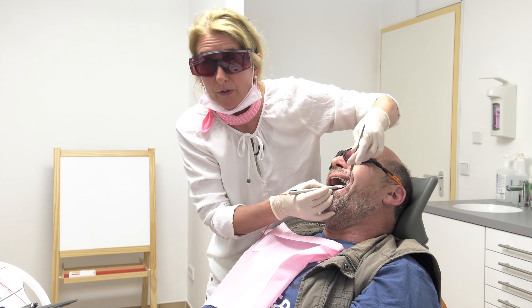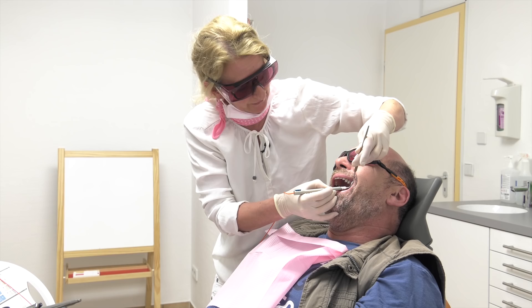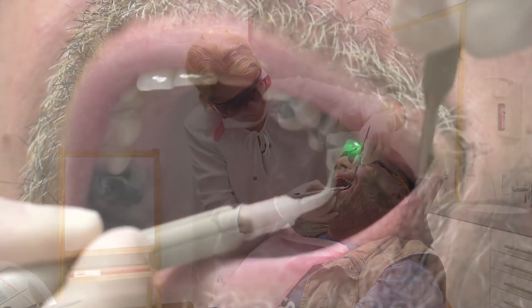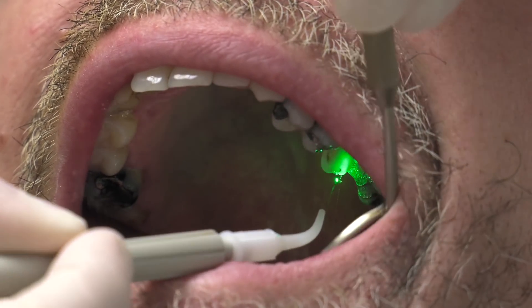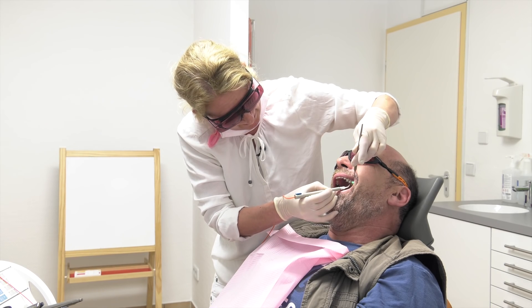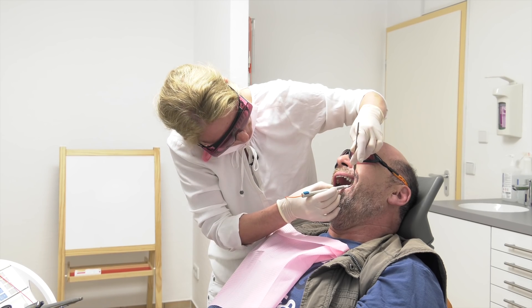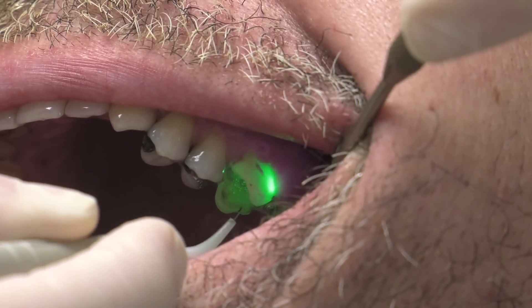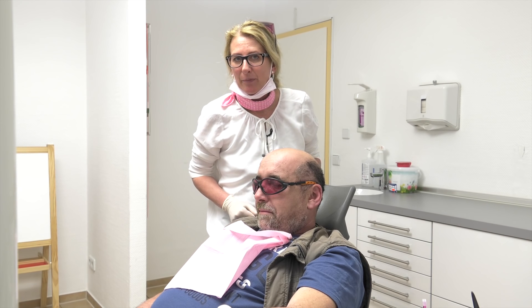The diode is a continuous wave. So I start moving the fiber before activating the laser, and I move the fiber very slowly out of the channel. I repeat this treatment three times for each channel like this. And you can see how the light goes very deep through the channel and through the jaw bone. The treatment is done.